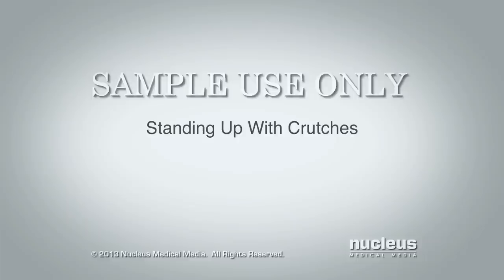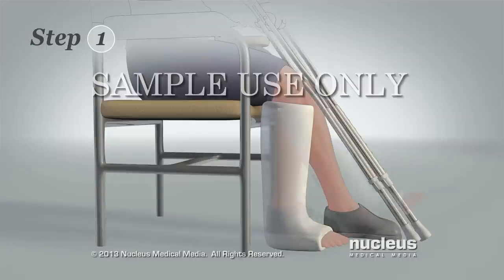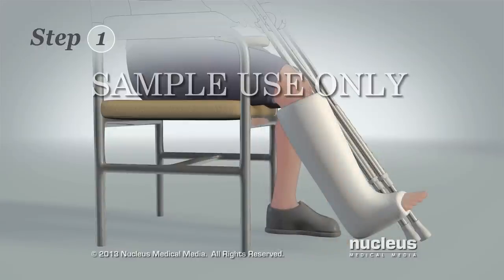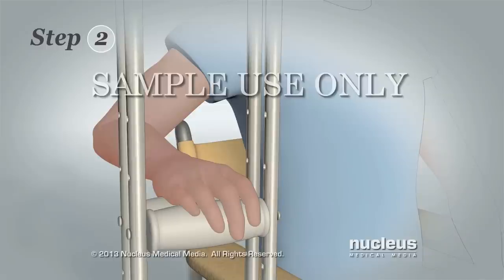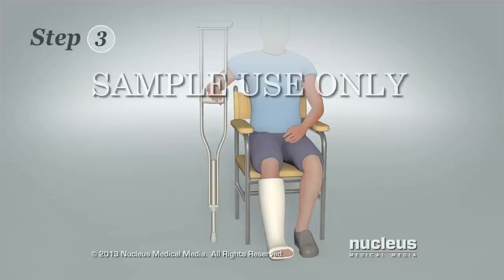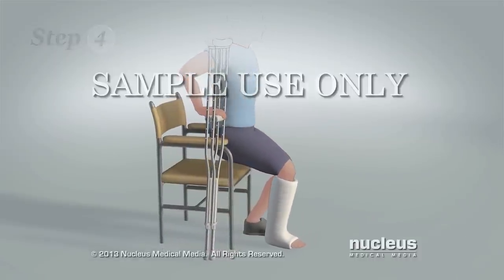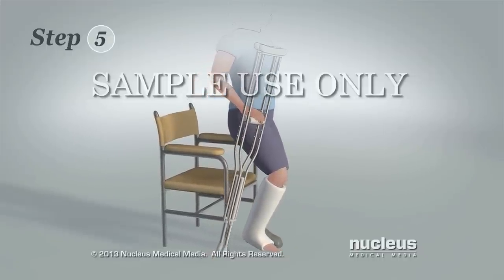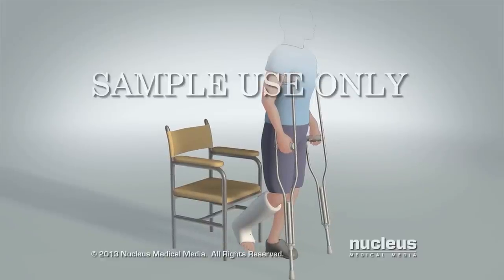Here's how to stand up with crutches. Step 1: While seated, extend your injured leg in front of you. Step 2: Move both crutches to your injured side and hold them by the hand grips with that hand. Step 3: Put your other hand on the chair seat or armrest. Step 4: While supporting your weight on the chair and crutches, scoot your body to the edge of the seat and then push yourself up to a standing position on your uninjured leg. Step 5: Put one crutch under each arm so that you are now in a tripod stance.